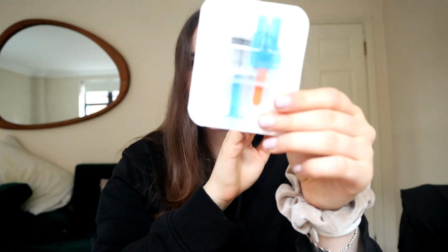Now we're going to do the reservoir, and with the Omnipod and stuff like that, I think you literally get the insulin out with a syringe from an insulin vial. So I have an insulin vial, but you don't use a syringe at all. You have the reservoir, and it has a filling device within it, but to change the reservoir we need to log it on the pump, so I'll show you how we do this now.